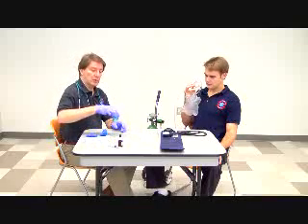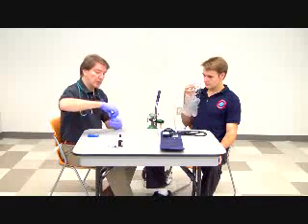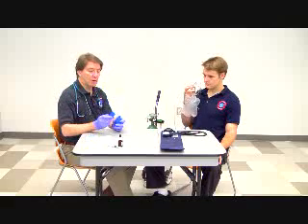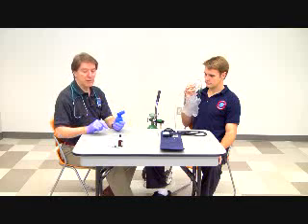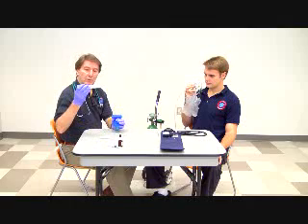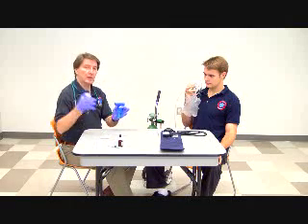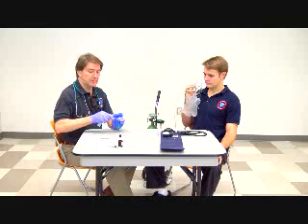Okay, you want to gently swirl the medication in the nebulizer bowl, screw the top of the bowl onto it, and we're going to apply this part, which is the T-piece. And the T-piece simply connects the mouthpiece and the collector tube to the device itself. This kind of collects the mist as we're producing it and prevents it from just kind of floating off into the atmosphere and being lost to the patient.